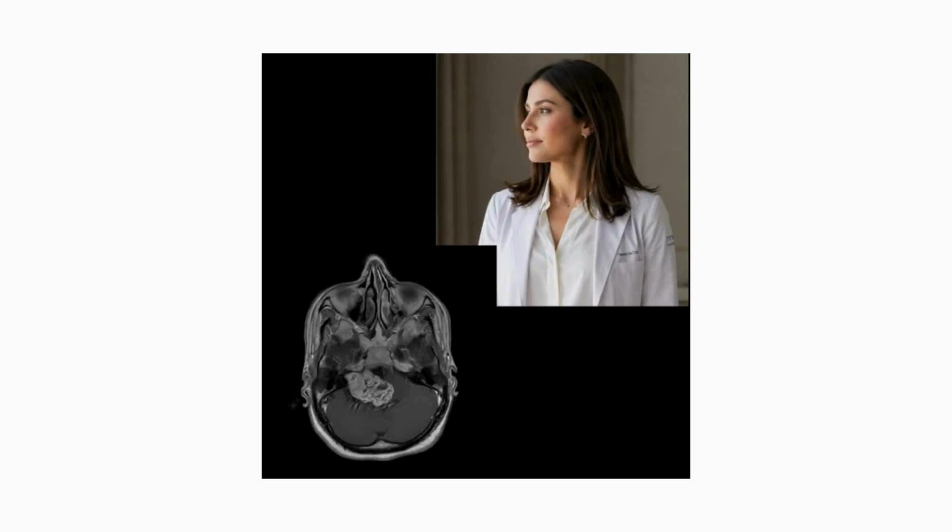Today, we aren't just looking at scans. We're solving the case of the silent angle. The clues: vestibular schwannoma versus meningioma. Let's walk through the most common suspect. Key teaching points.